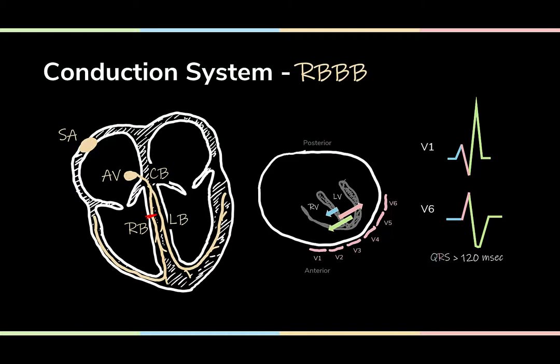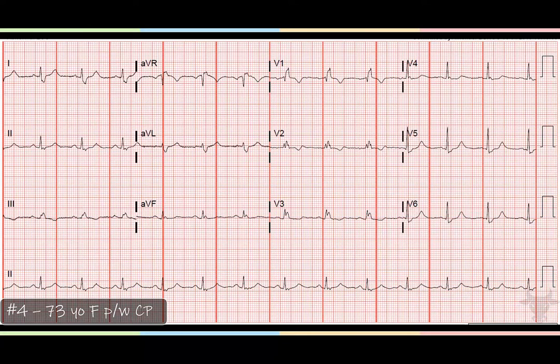Yeah, love it. Now we're going to look again at the EKG for this individual, and we do see that there is an RSR prime. That R is kind of hard to see, but it's there. You can actually see it much better by the time you get to lead V2 here. And by the time you get to V3, that R is getting bigger. The R prime is kind of going away. V4, the R prime is almost totally gone. You see a little notch there. And then by V5, now you've got your wide S.